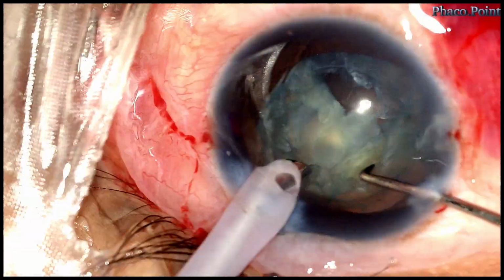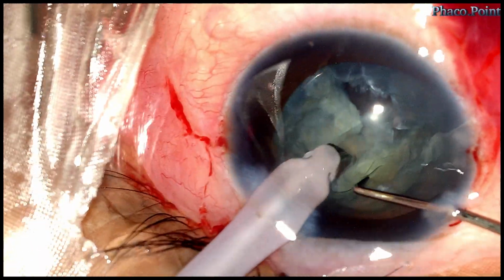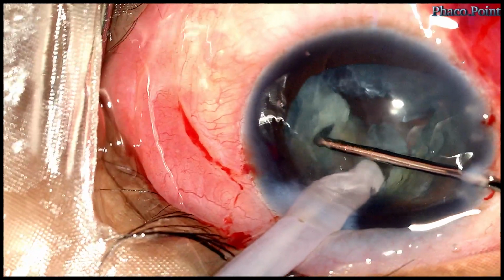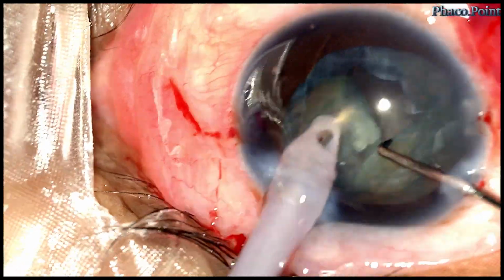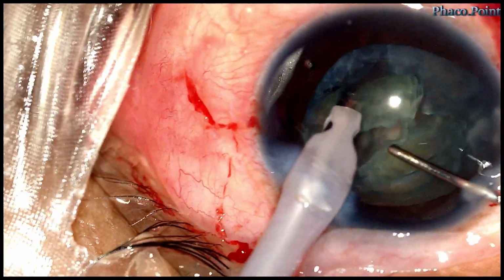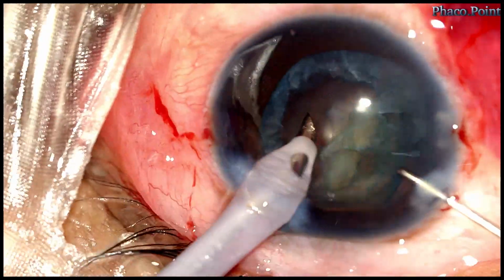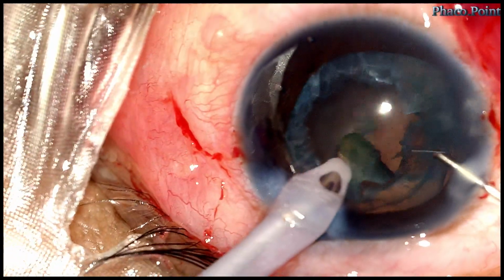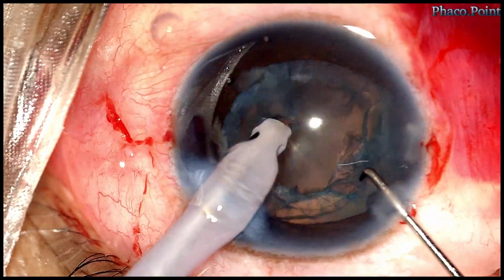So to reduce the manipulations within the eye, I sculpt down to the center of that heminucleus, break it down into 2 halves, and turn by turn without rotating the nucleus, bring each of the fragments up into the anterior chamber and emulsify them in the phacosafe zone, that is the zone of the pupil. After which, I proceed to the epinucleus removal.